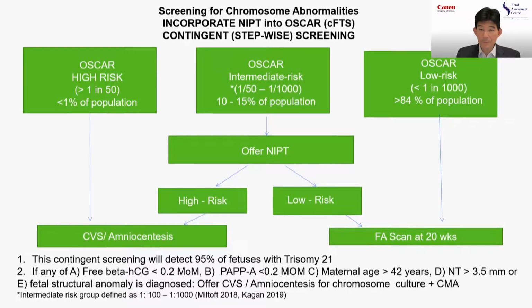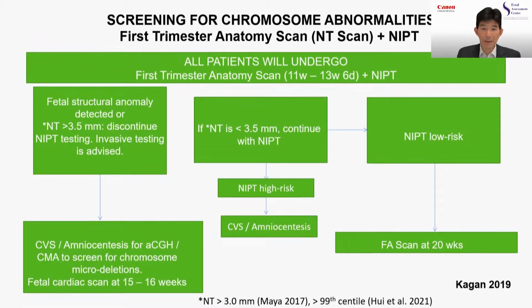Or lastly, to answer the scenario that I posed you, the last scenario, I think most of us would be veering more towards this anyway, and this is actually what's happening in most practices these days. You get a patient in the first trimester. If they've done the NIPT, you still do the first trimester scan. If they haven't, you do your first trimester scan. You make sure that they haven't got any abnormalities, make sure the nuchal is normal, and then you offer them the NIPT.